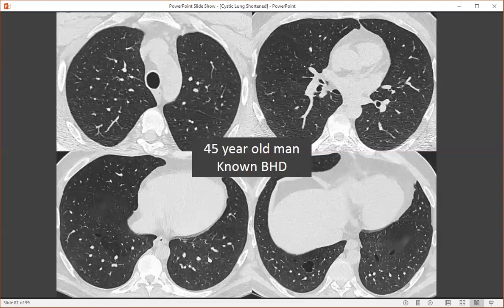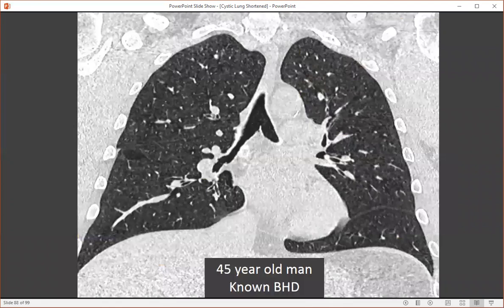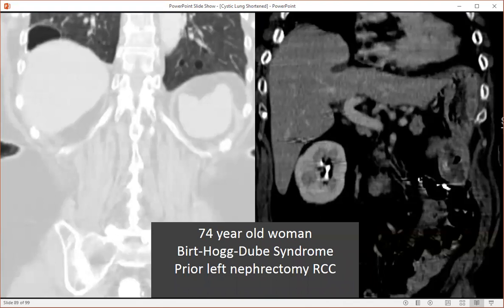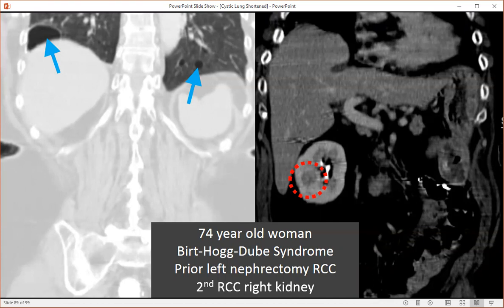Here's a 45-year-old man with known Birt-Hogg-Dubé. This person demonstrates characteristic features of lower lung zone predominant oligocystic lung disease. These cysts have a lentiform shape, and several are located adjacent to fissures. Here's a 74-year-old woman with Birt-Hogg-Dubé with prior nephrectomy for renal cell carcinoma. We can see the characteristic lower lung zone oligocystic lung disease with juxtapleural location. In the upper abdomen, the left kidney is absent, but the right kidney showed an enlarging hypoattenuating lesion confirmed to be a second renal cell carcinoma. This is why these people should be screened — often with MRI of the upper abdomen — and why it's important to make this diagnosis, as this is an autosomal dominant disease associated with development of renal cell carcinomas.